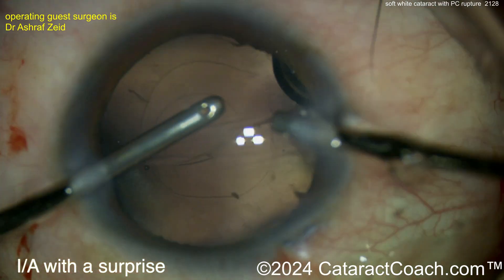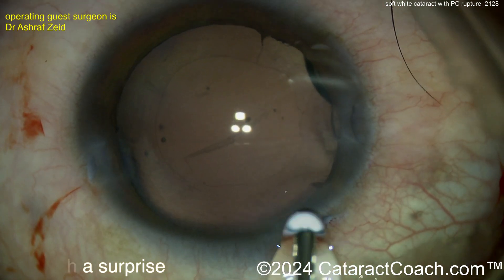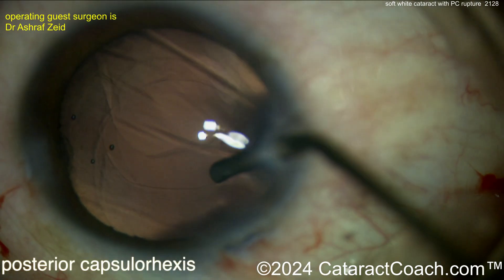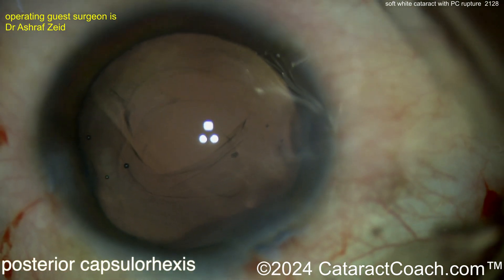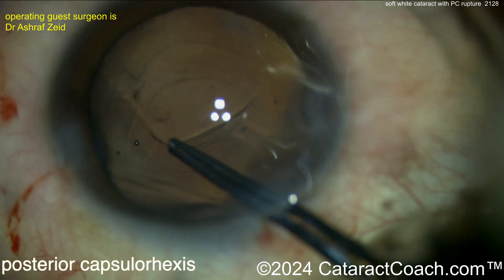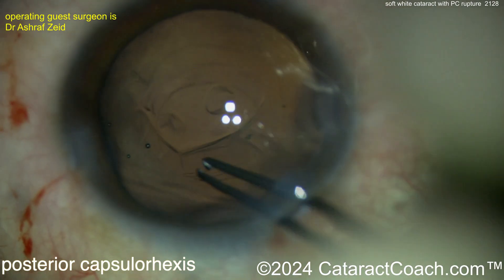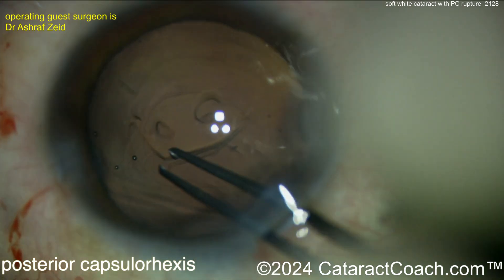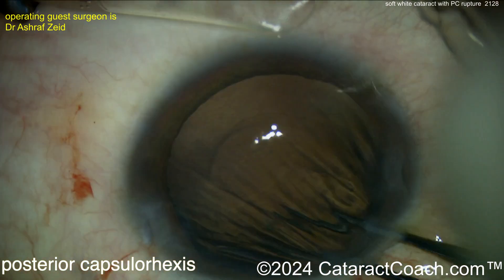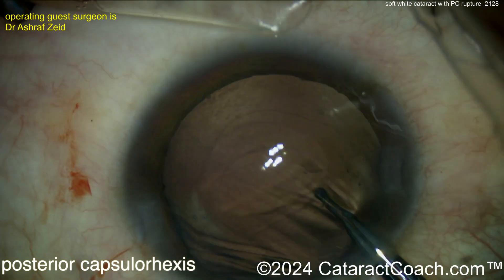Cleaning up all of that lens cortex — don't let the eye collapse. You may want to leave the infusion in until you can place viscoelastic. Now attempt a posterior capsular rhexis if you can; that will help prevent the posterior capsule break from extending even more. If you can grab down there with your capsulorrhexis forceps just to create something continuous — it doesn't have to be perfectly round, as long as it's continuous it likely won't run out as much.